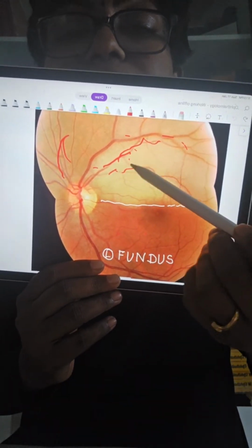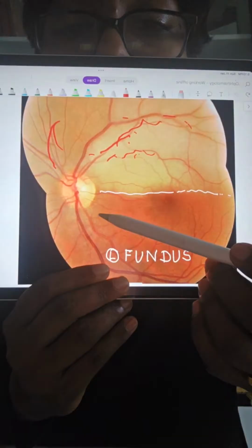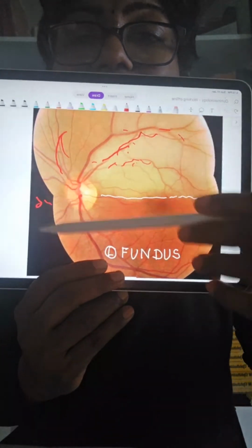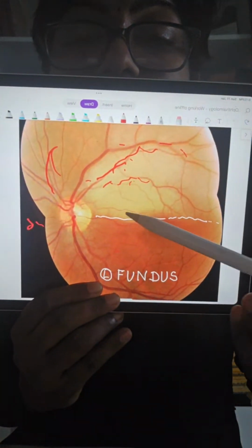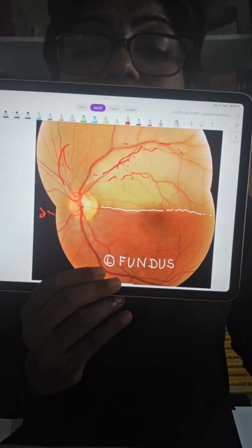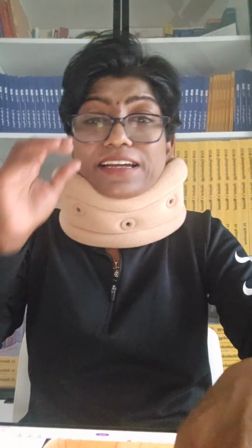So what do you think this is? So this is a hemiretinal artery occlusion, half. Yes, that was branch. So this is the superior half. So this patient will have the entire inferior half visual field defect, and probably even the fovea is involved here. Yes, correct. Although we don't write anywhere as HRAO, but yes. So do you understand? So you can get a visual field defect.